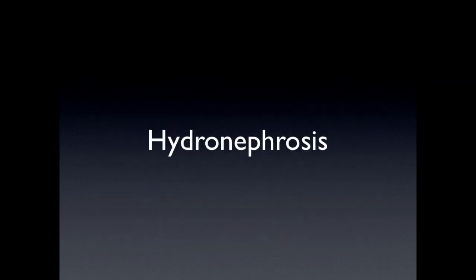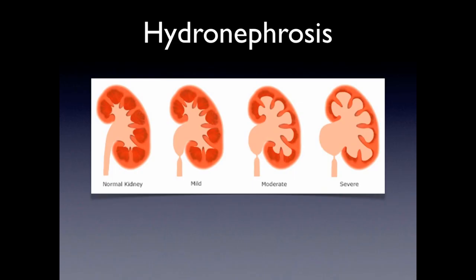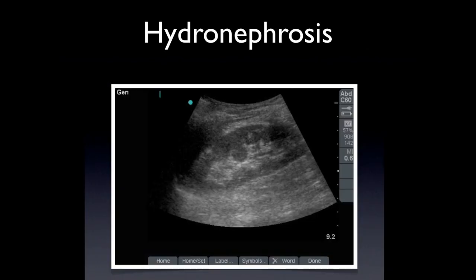You can identify hydronephrosis using ultrasound, and there are several degrees from mild to moderate to severe. Mild and moderate are a little bit more subjective. But when you get to the severe type, you definitely see a very obvious dilatation and some cortical thinning. This image shows a coronal view of a kidney, and you can see the collecting system with no dilatation. It's hyperechoic — this is a normal view of a kidney.